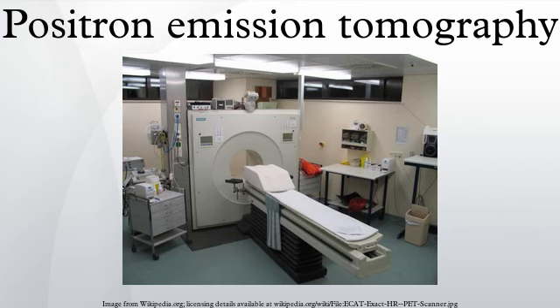Description: Operation. To conduct the scan, a short-lived radioactive tracer isotope is injected into the living subject. The tracer is chemically incorporated into a biologically active molecule. There is a waiting period while the active molecule becomes concentrated in tissues of interest. Then the subject is placed in the imaging scanner. The molecule most commonly used for this purpose is fludeoxyglucose, a sugar, for which the waiting period is typically an hour. During the scan, a record of tissue concentration is made as the tracer decays.